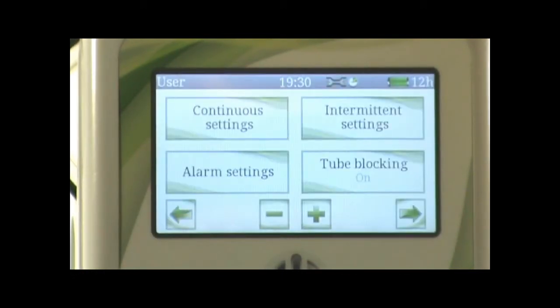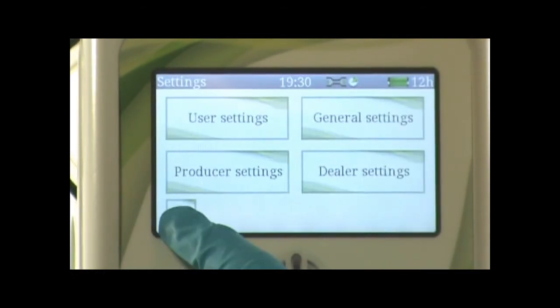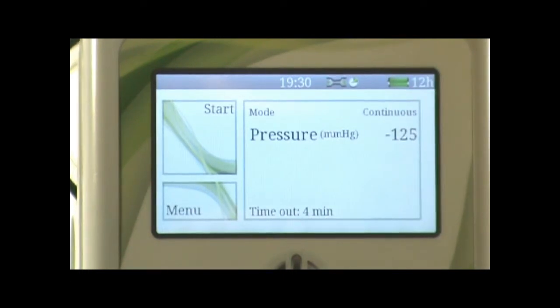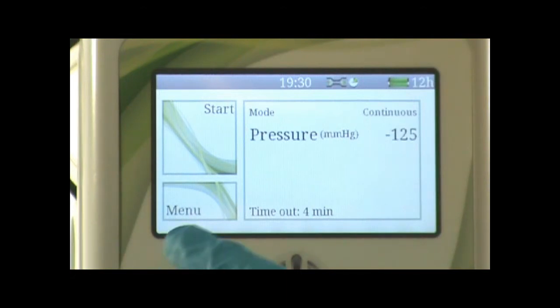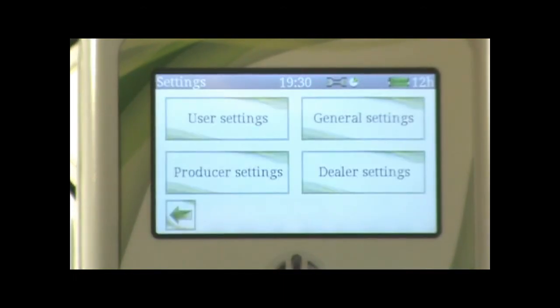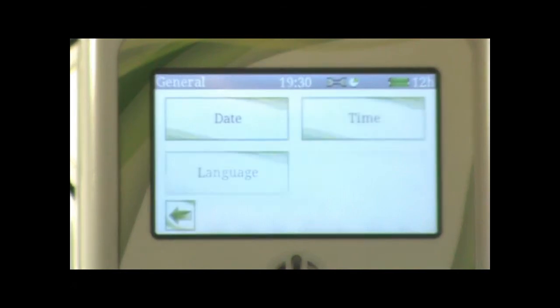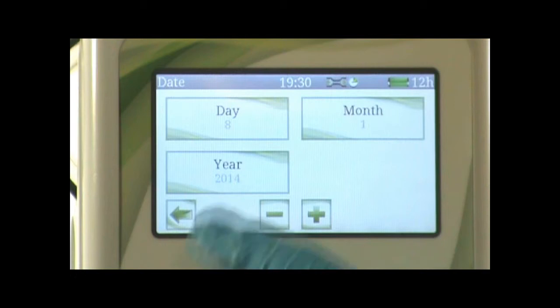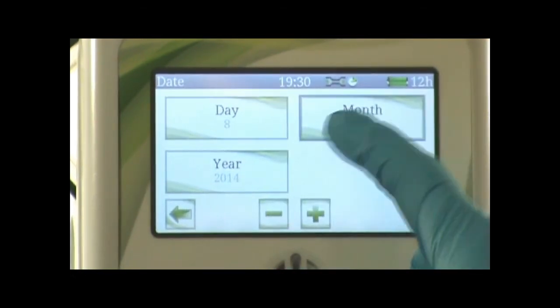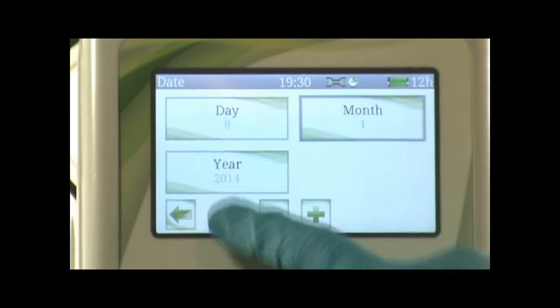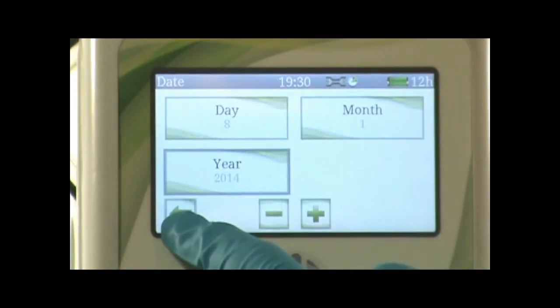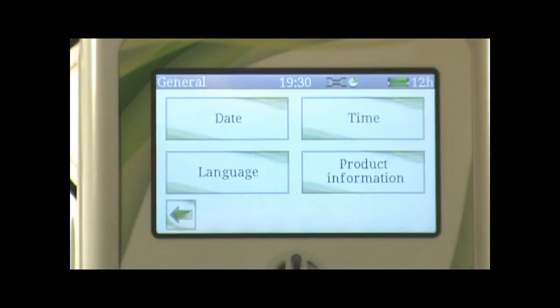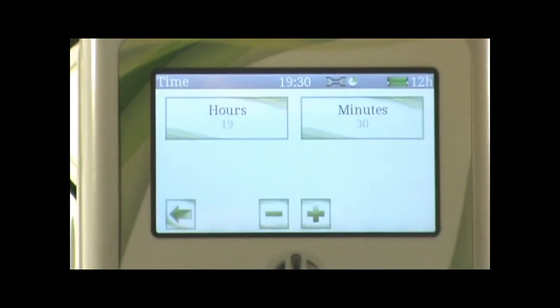Press the back button to return to the main menu. To set up date and time, press the menu button, then general settings, then press date. You can change the date, the month, and the year in this panel. Press the day, the month, and the year, and you can adjust by pressing the minus and plus signs.